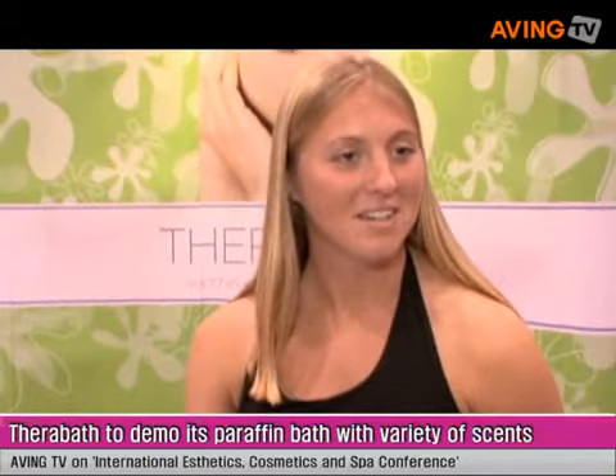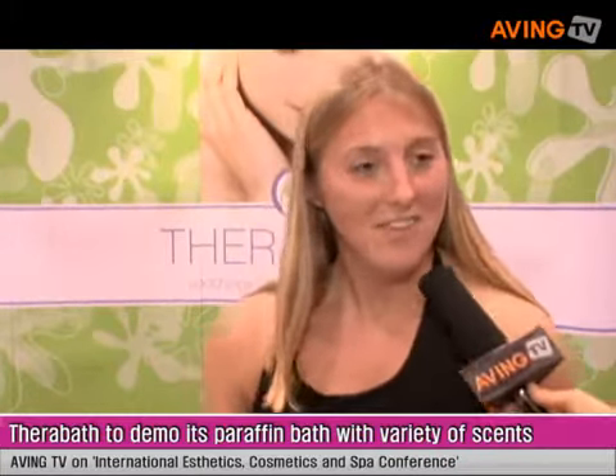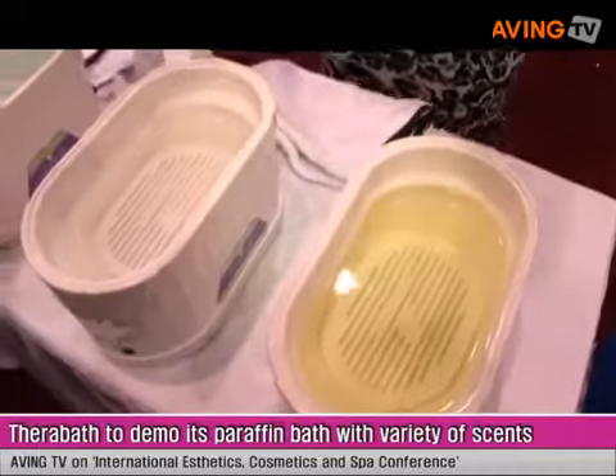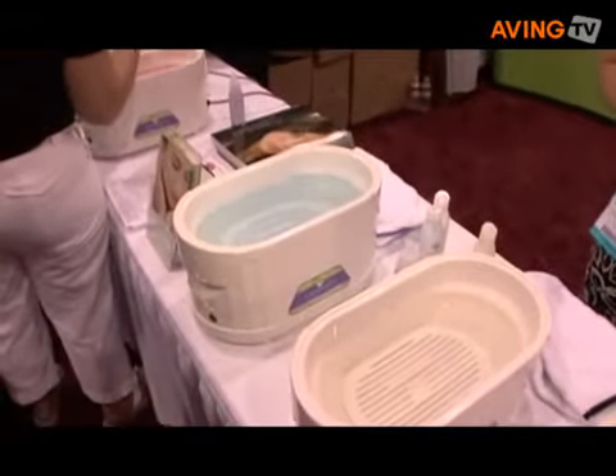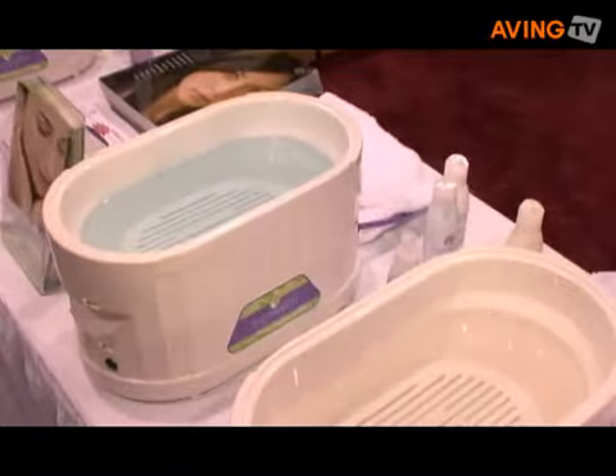Tell me about some highlight products at the show. These are new scents of paraffin, so they have fun scents, fun colors. You get the aromatherapy benefit, and we've also added some essential oils to them as well.